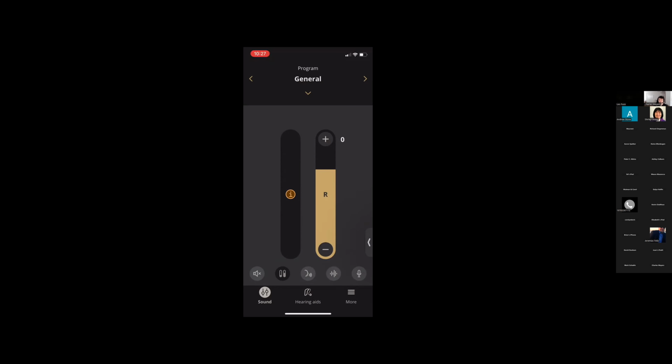So I'm going to take a quick moment just to say, right now I've spoken about 2 times that your prescription is relevant. And the reason I do this is because hearing can change. It's important that you get a consistent evaluation from your doctor, because what can happen is if you lose a different pitch or a different area of your hearing, turning the hearing aids up to a higher volume is not going to solve the problem, because you don't have good access to that pitch.